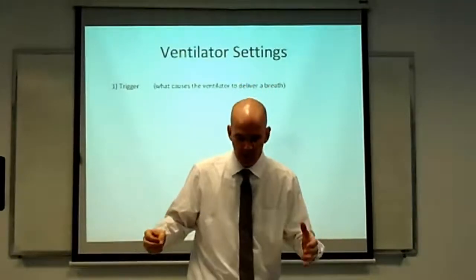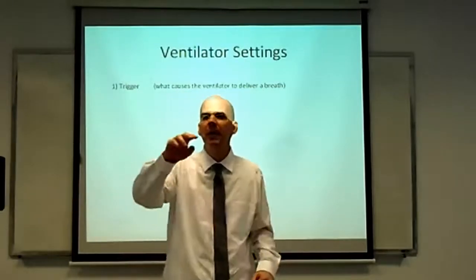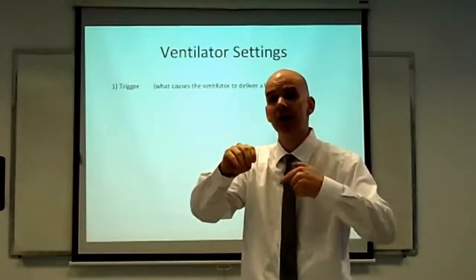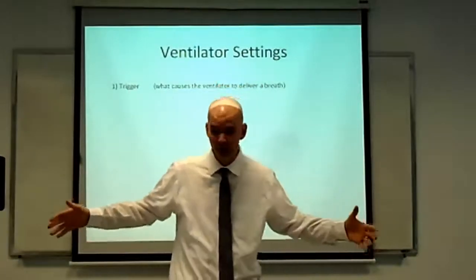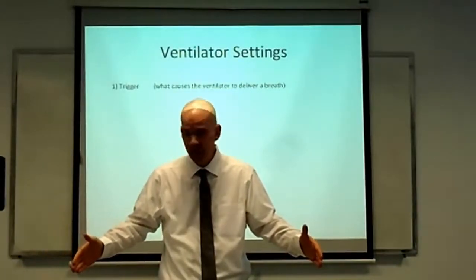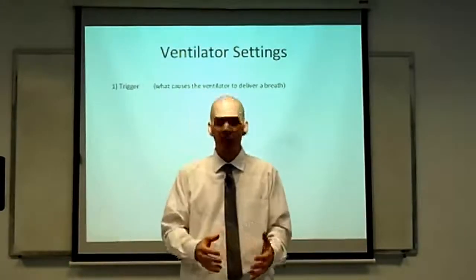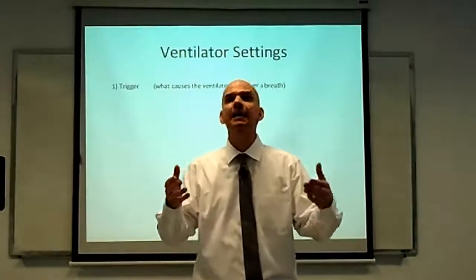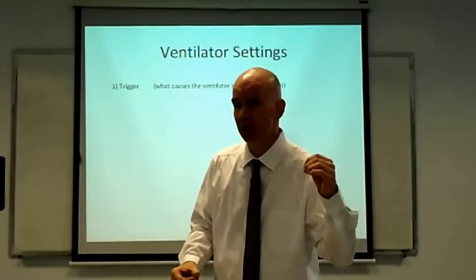A patient, for instance, might be mid exhalation, and the machine might pick up a little oscillation in the pressure, misinterpret it as an effort to take another breath, and fire a breath inappropriately. Remember, I said the patient hadn't finished exhaling yet, so this new breath comes in before he finished exhaling. This new breath stacks on top of the old breath, and the patient's lungs get blown open further and further, and he can get excessive stretch and a complication called barotrauma that we'll discuss more later.